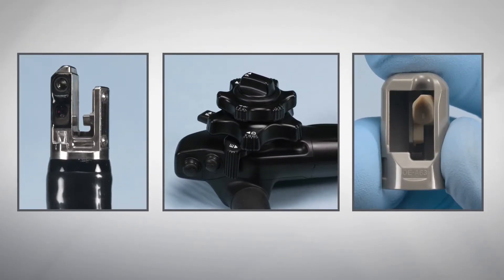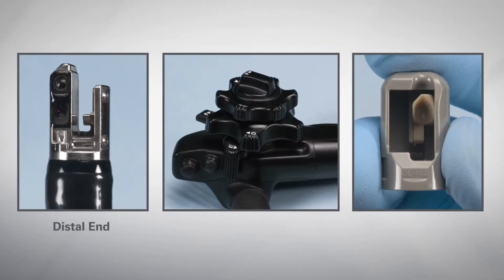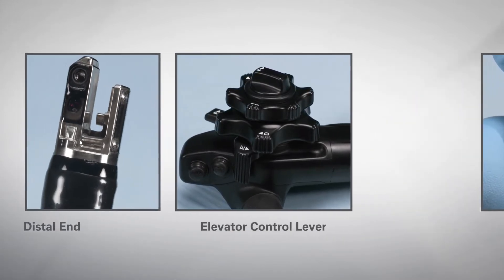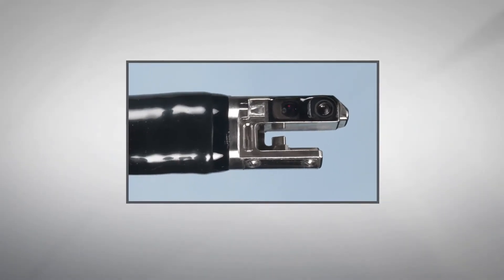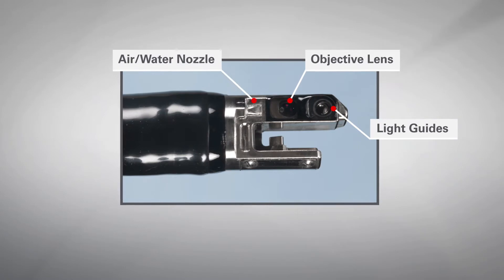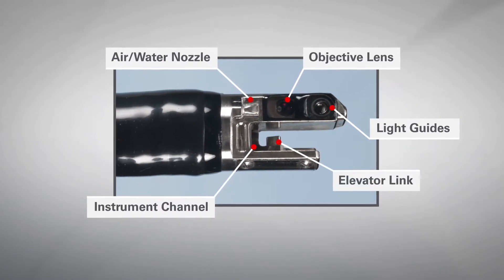Prior to attaching the elevator cap to the endoscope, inspect all components of the distal end of the scope, the elevator control lever, and single-use sterile elevator cap. Inspection of the distal end of the endoscope includes the objective lens, light guides, air-water nozzle, instrument channel, and elevator link.